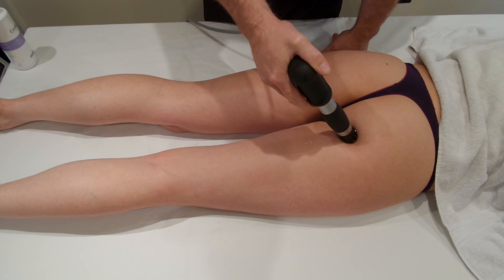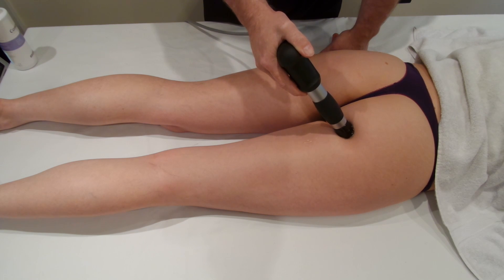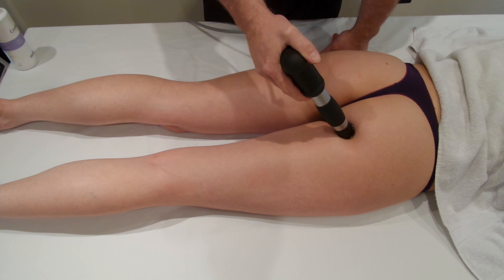There have been a couple of studies looking at this area and they've all shown good results, as long as you go higher with the shockwave. Don't be afraid to go above 3 bar if the patient can take it — 4 bar, 5 bar.